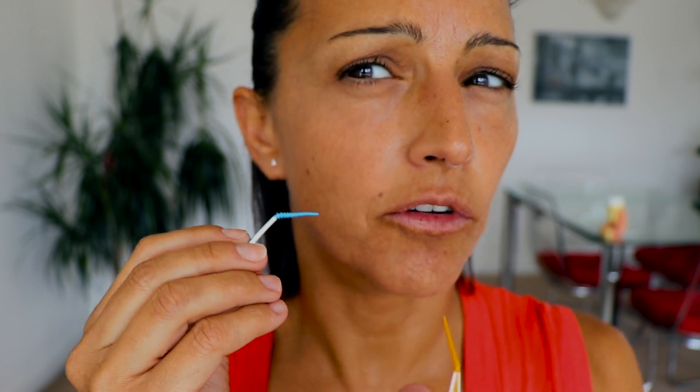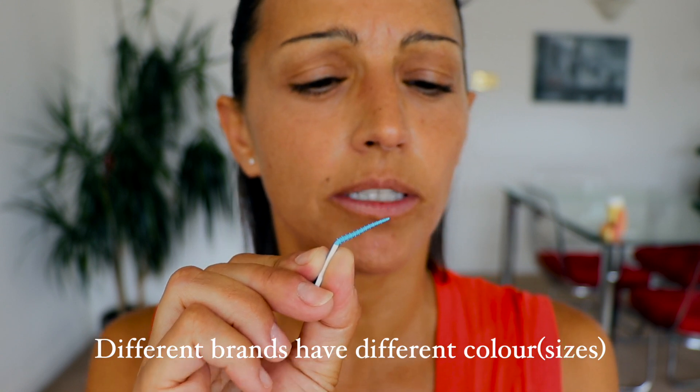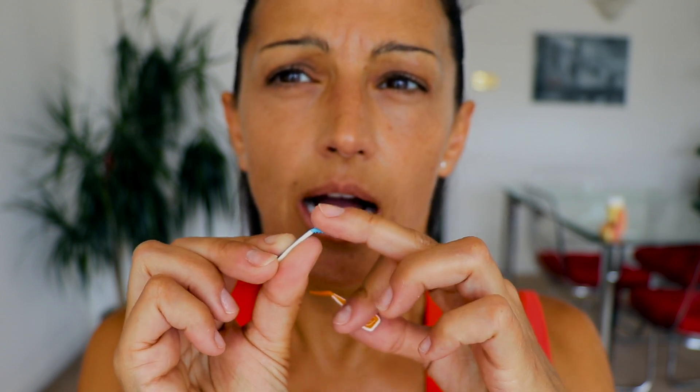I'm going to show you on the lower teeth where I have a bit more space. If you don't know how to floss, using the interdental brushes will remove plaque from under your gum line. The blue one is the wider one and the orange is the smallest, for small gaps. You should use the bigger one that goes through the space, but you don't need to apply very much pressure to get through.